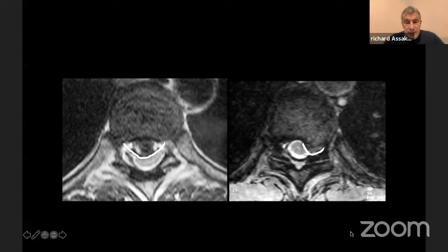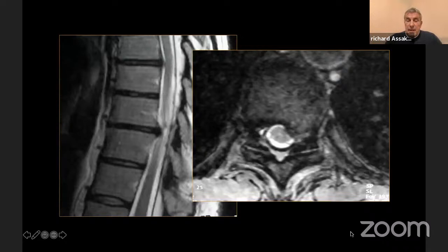And as Ziya said earlier, the one on the right could be approached posteriorly, especially if it's a soft disc. The one on the left is very risky and dangerous, and we should avoid the posterior access unless you are a master of extracavitary access and you can go far lateral to get to the anterior aspect of the cord. In my hands, the one on the left is a good candidate for anterior surgery, even direct access. So let's start with the posterior access and show you my latest technology to get out those soft discs posterolaterally located.